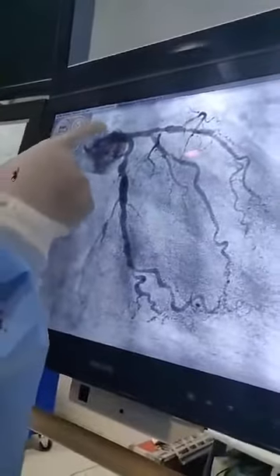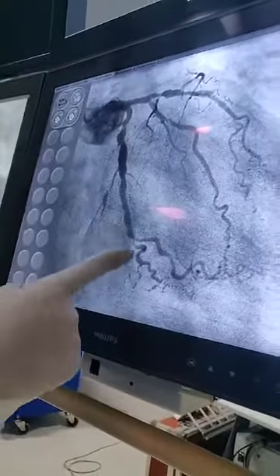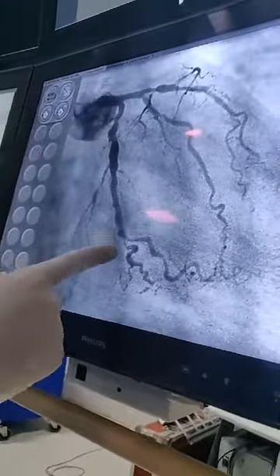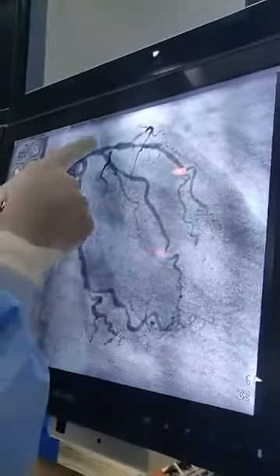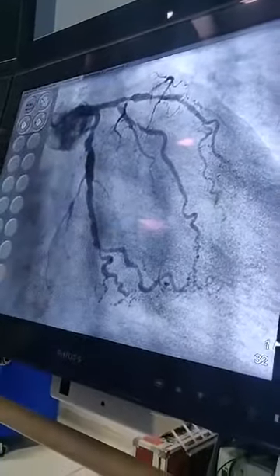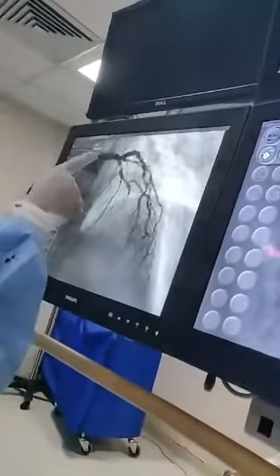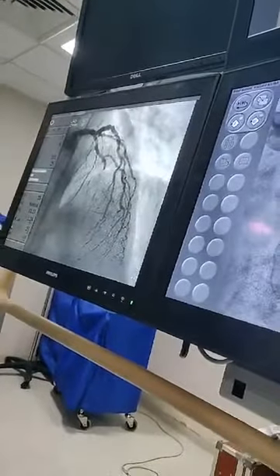Now the angiography has been done. This is the left main coronary artery dividing into left circumflex. There are some blockages at the distal part of the circumflex, which is about 70 to 80%, but the artery supply is too less. This is the left anterior descending artery, and this is a large diagonal. In this view you can see the patient has 100% blockage here — it is 100% blocked.